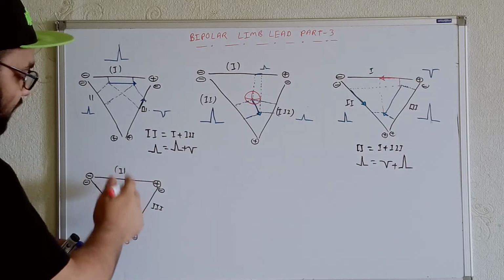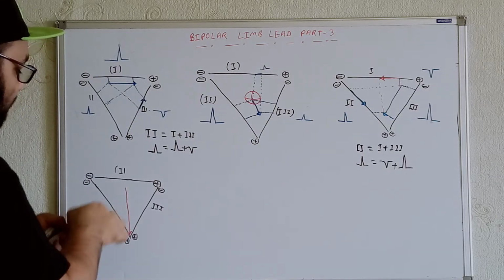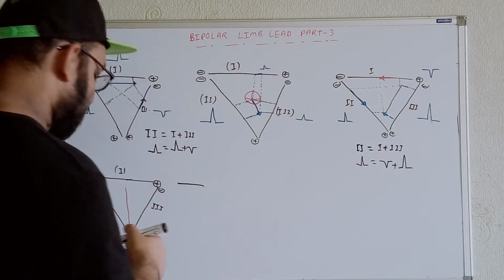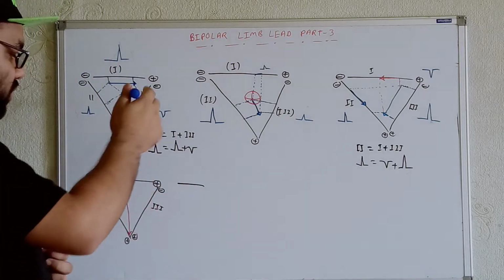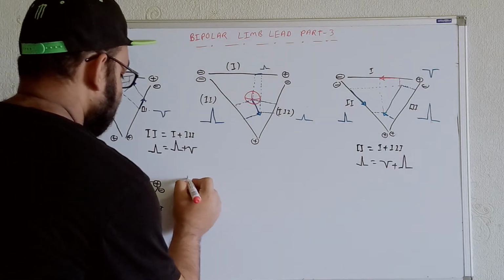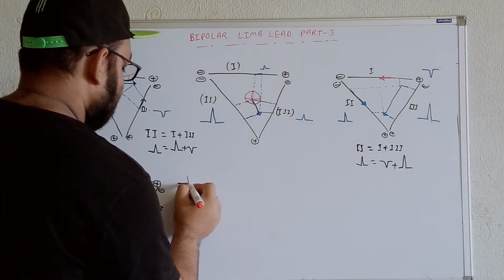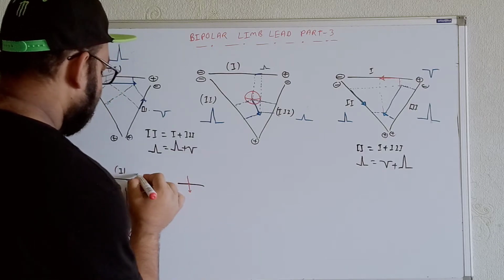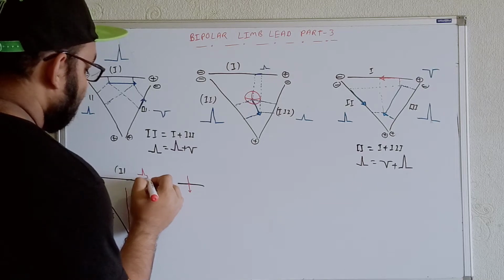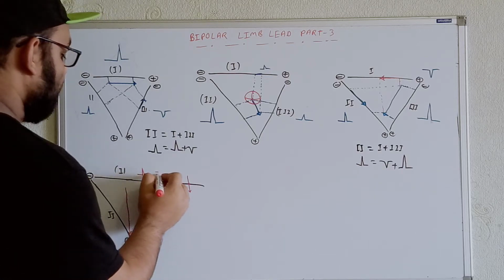Now see, whenever it comes perpendicularly, in terms of lead number 1, whenever the major ventricular depolarization is coming in a perpendicular direction with respect to lead number 1, at first it is coming towards, then whenever it touches lead number 1, it goes away. So whatever we'll see over here, at first we'll get the positive deflection. After that, whenever it touches and crosses away, again we'll get the negative deflection. Ultimately we'll get 0 deflection over here.